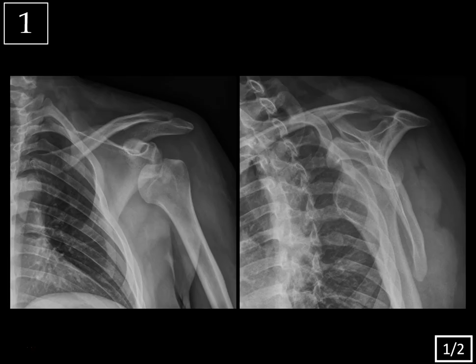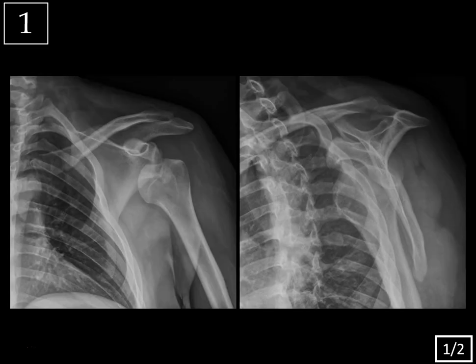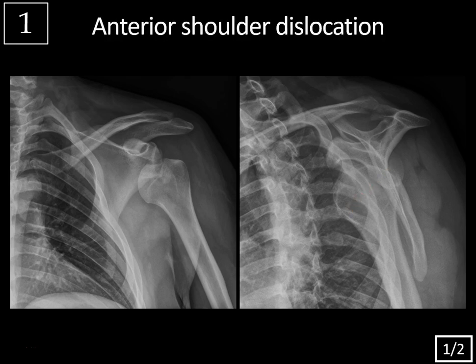Case 1. We're looking at two x-rays of the left shoulder. On this frontal view on the left-hand side, notice how the left humeral head is located inferior and medial to the glenoid — here's the glenoid. The humeral head is in a subcoracoid location. This is the coracoid, and there's the clavicle and acromion. On the scapular Y view, the humeral head should be overlying the glenoid region, but instead it's dislocated anteriorly.